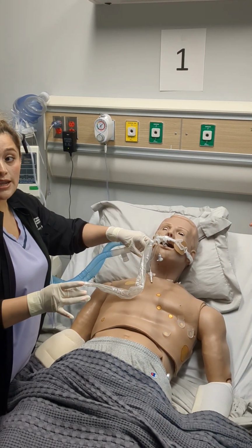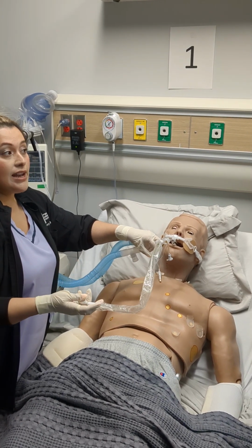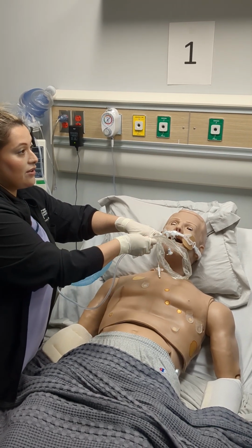I'm inline, hyperoxygenating the patient for 30 seconds to a minute. Well, those are open. If I need to go down there one more time, I'm sterile. I'm going to put this back here, okay?